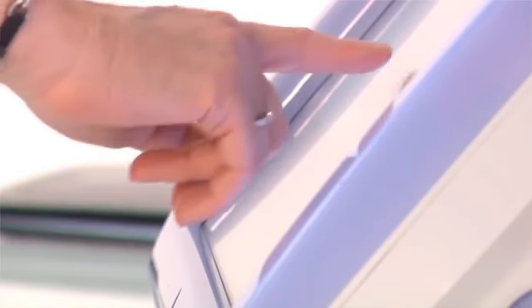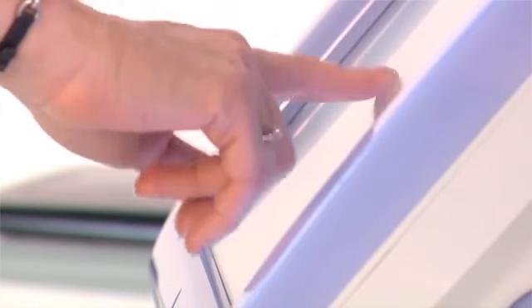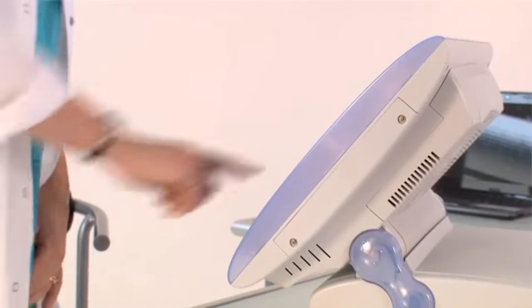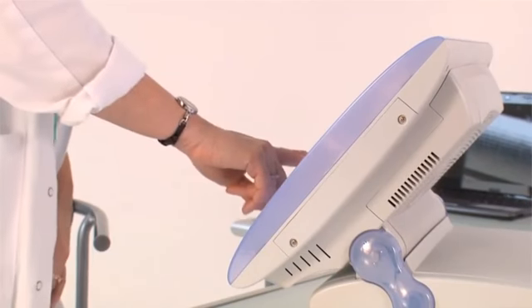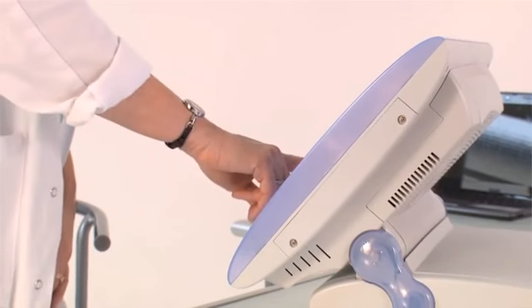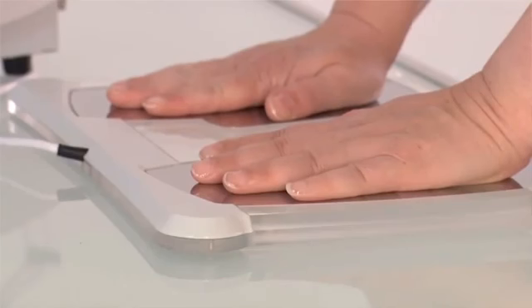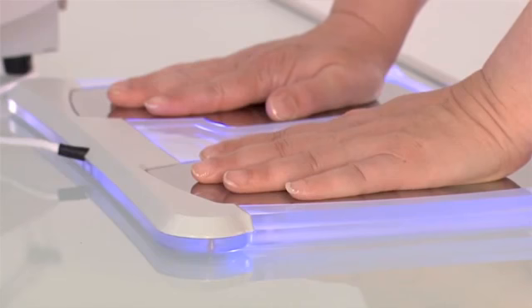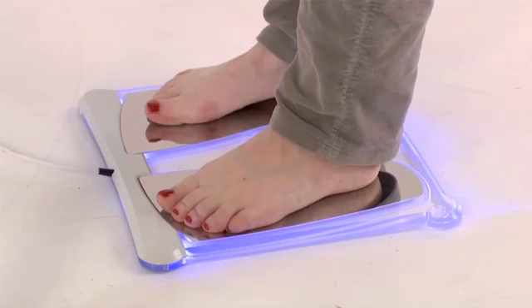The patient's name, ID, age, gender, weight, and height are typed into the analyzer. The test starts when the scan button is pressed. As the test starts, the sensor plates auto-calibrate, and a small direct current of less than 4 volts is applied to both the hand and foot sensor plates.